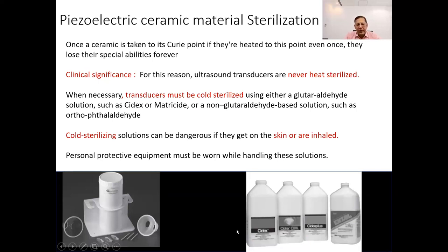For this reason, ultrasound transducers, which rely on these special ceramic materials, are never heat sterilized. When it's necessary to sterilize ultrasound transducers, they have to undergo a different process called cold sterilization.